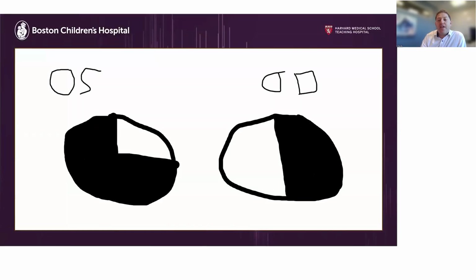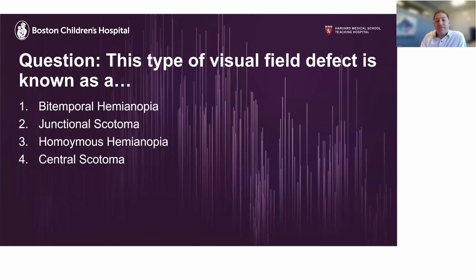This is my gross attempt at the visual fields I did because I was a fellow when I saw him and I was in the emergency department, didn't have a Humphrey visual field, but it looks like he has a significant visual field defect actually in both eyes.